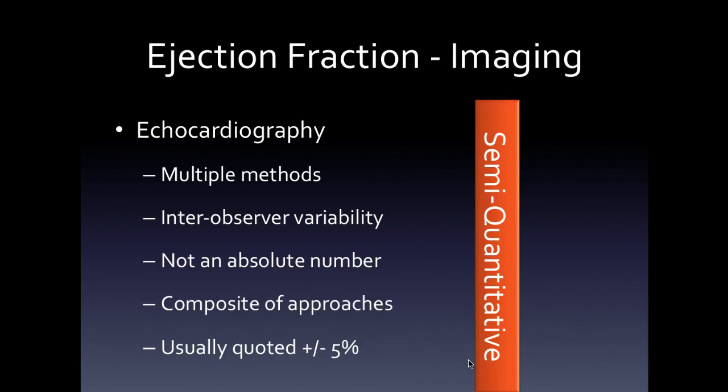And everything we do in echo is to try and make an estimate, make some sort of measurement without using the extraordinary lengths you actually have to go to measure actual ejection fraction in the physiological model. So for that reason, there are multiple methods. For sure, there's marked inter-observer variability, and that's where I think the repetition, the looking at the normals, has to be there. And also, what should be done in a good core lab is that maybe 10% of echoes are read twice.